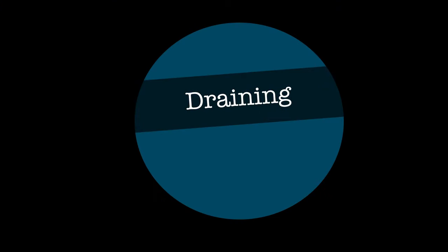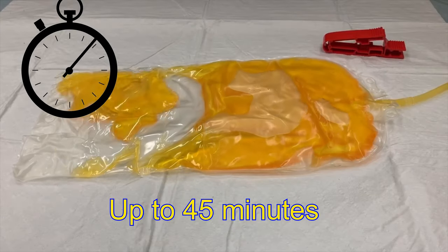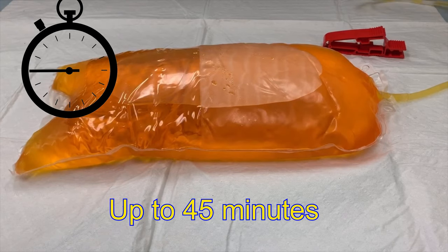Everything is now in place to begin the draining phase of peritoneal dialysis. Open the drainage line clamp and the patient clamp — the fill line clamp remains closed. The drainage bag will begin to fill with peritoneal fluid. This may take up to 45 minutes. You do not need to remain in the room during the drainage period. Instruct the patient to hit the call light when they're finished draining, or you can return to the room in 30 to 45 minutes to check on the progress.